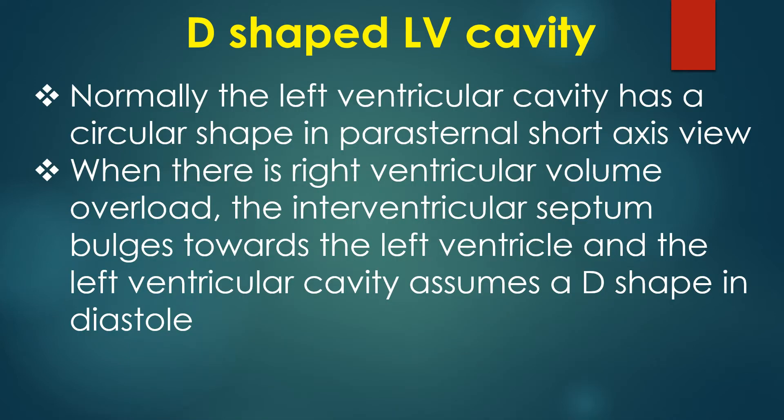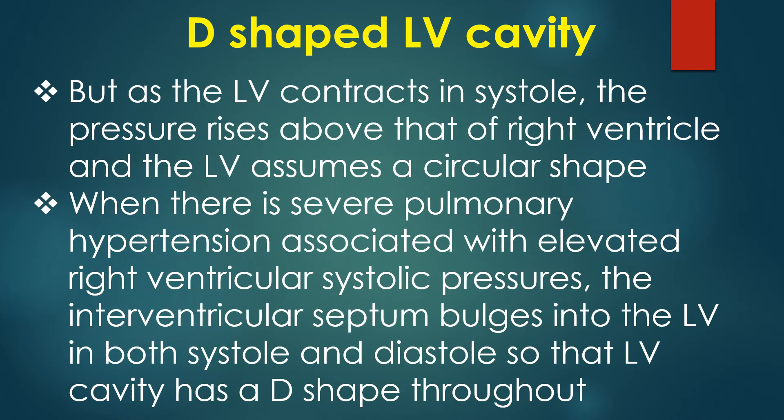Normally, the left ventricular cavity has a circular shape in parasternal short axis view. When there is right ventricular volume overload, the interventricular septum bulges towards the left ventricle and the left ventricular cavity assumes a D shape in diastole.